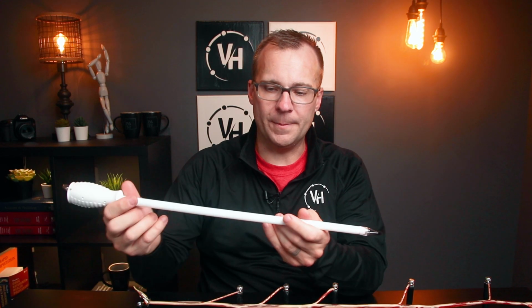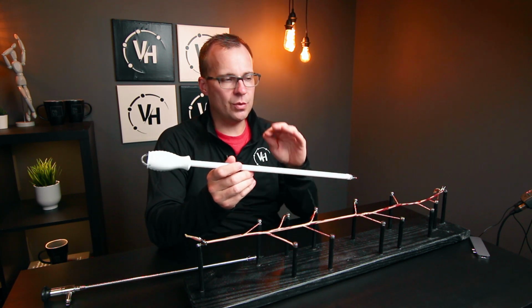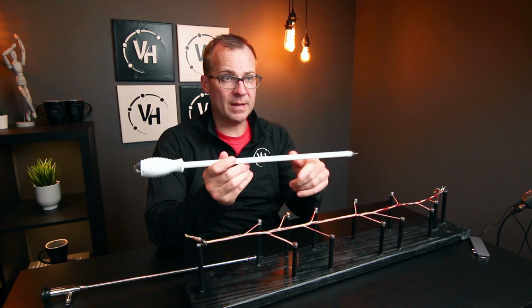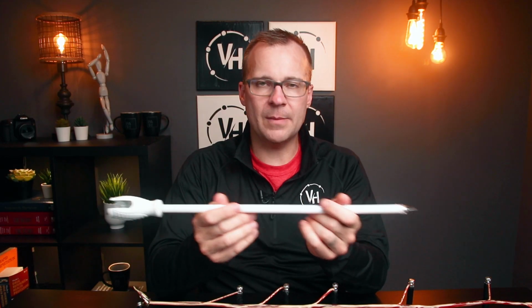And so when we do insert the harvester, it's going to be a pretty big problem. It's much, much easier to clear off the connective tissue, develop the branches, and we'll talk about what that means here in a second, with the dissector than it is to rush through this step and get to the harvester.